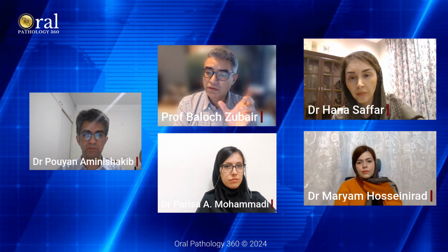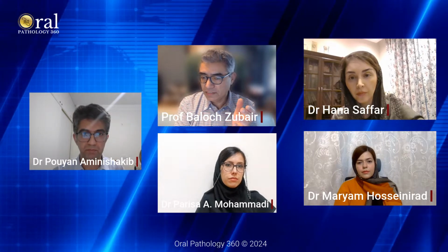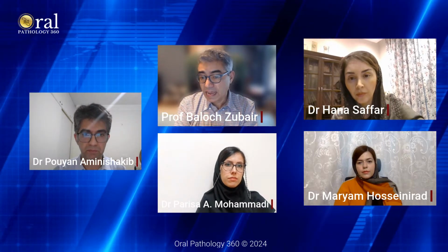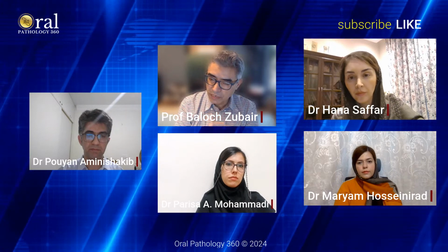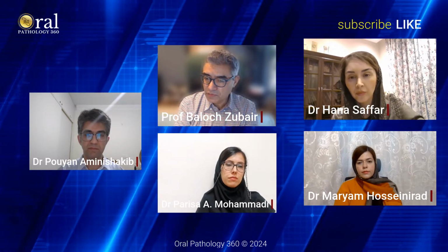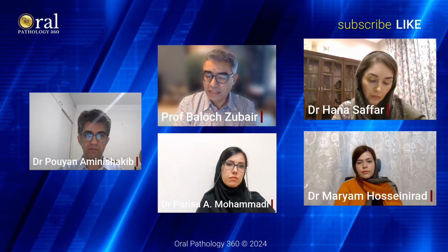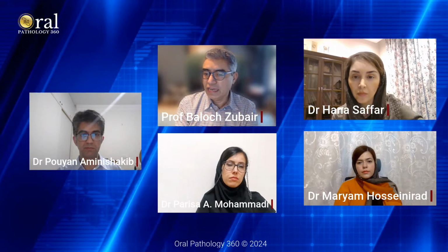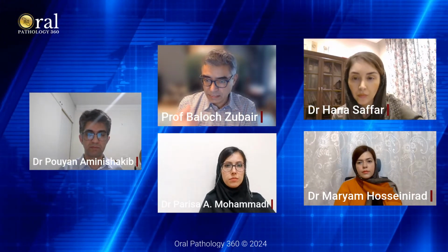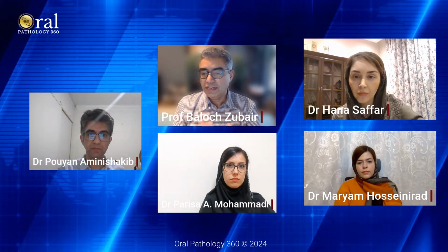I personally will make extra smears, Diff-Quik smears, if that is going to be my differential, or a cell block, and I will do FISH for MAML2 too, because to me that really is the one that gives the diagnosis. But one has to understand, only 68% of mucoepidermoid carcinomas have MAML2 rearrangements. All of them don't, especially in this category of Warthin-like or oncocytic mucoepidermoid carcinomas. So I always tell the surgeon that this is what I'm dealing with.